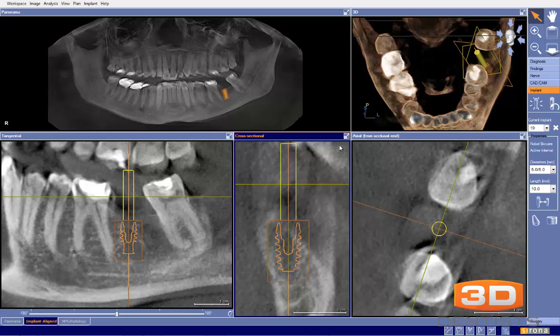In terms of the grafting, one option is to do lateral grafting prior to implant placement, or using some of today's biologics, either BMP or more commonly PRF, using centrifuged plasma blood. We can actually use the sticky bone technique and do ridge augmentation at the time of implant placement.